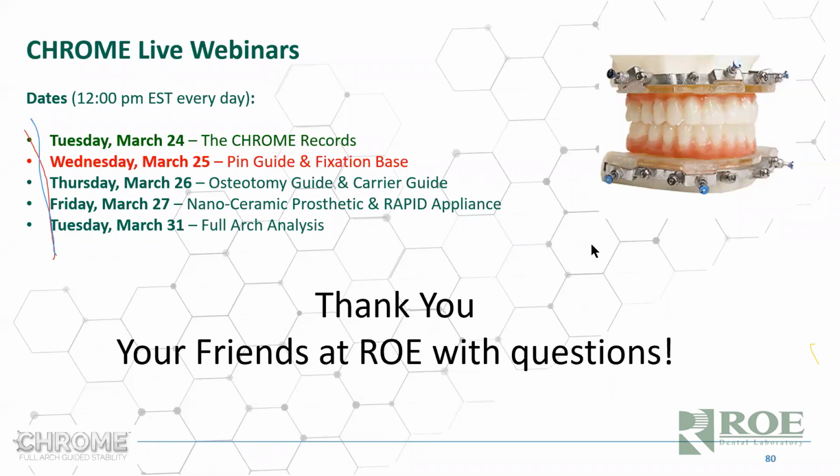And so essentially we end up with a denture with a plate attached to it, and we have to virtually remove the two. They morph together. So instead, put a piece of foam, it can be pretty thin, half an inch, quarter of an inch, on the chin rest or on the plate, then put the denture on top of that. And on our end, it appears that the denture is floating in space. And it could be right side up or upside down, doesn't matter. We can reverse it later.